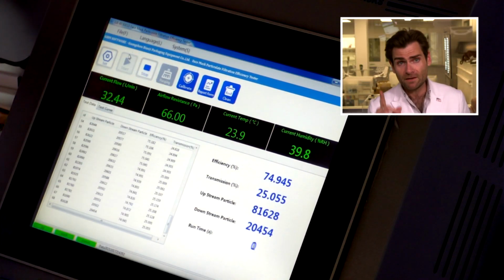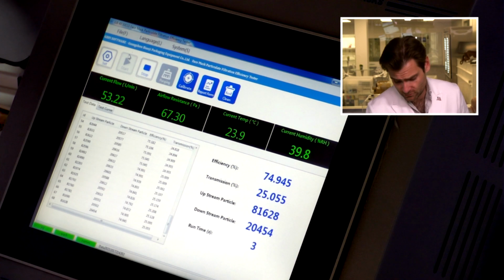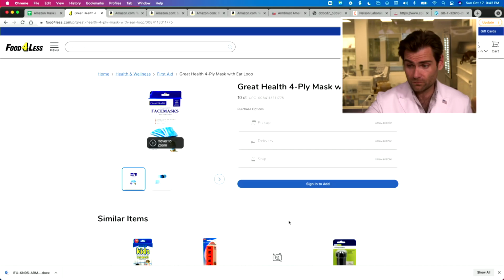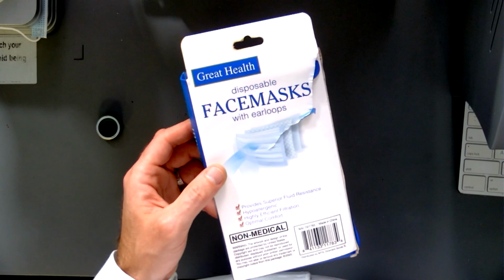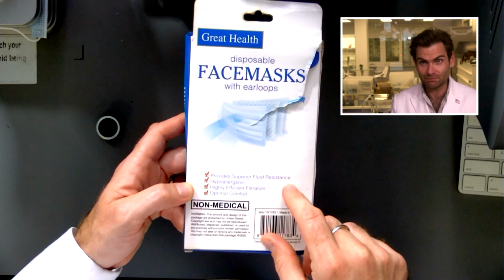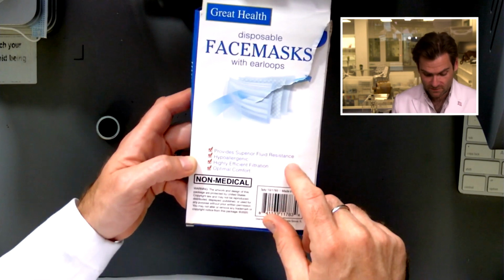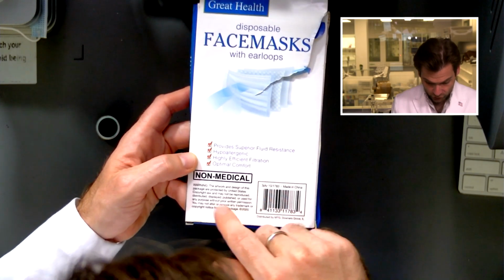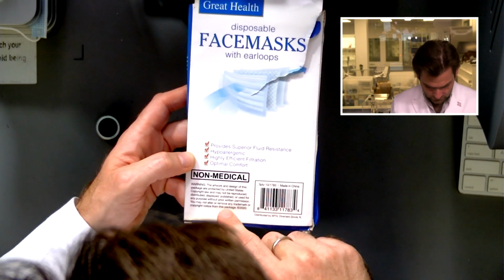Let her rip. This is a PFE machine, Particulate Filtration Efficiency Machine. If you want to find out how this thing works, check out this link. We're basically doing the American Surgical Mask test here, holding these guys to ASTM standards. Now, I don't see really anything useful on the website, Food for Less, so we're just going to jump right at the box. Provides superior fluid resistance, hypoallergenic, highly efficient, optimal comfort, non-medical. Manufactured in China.